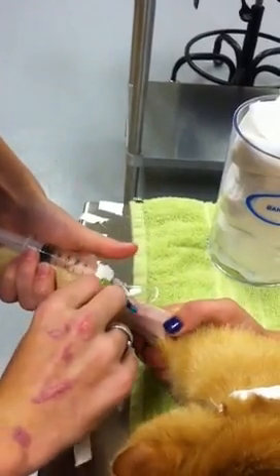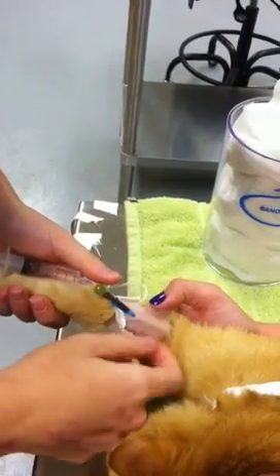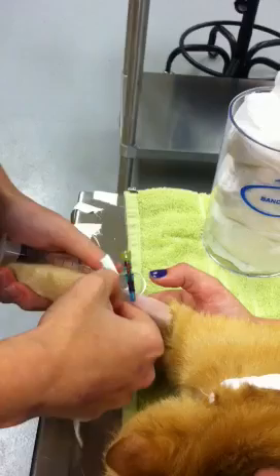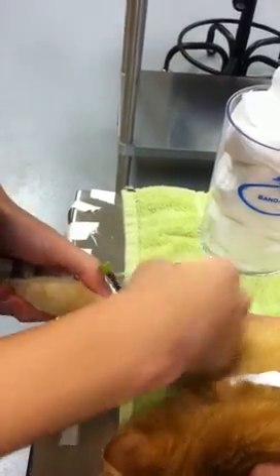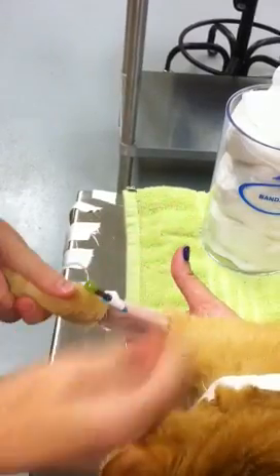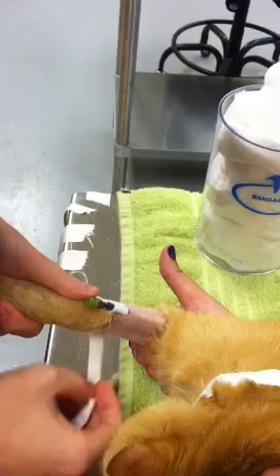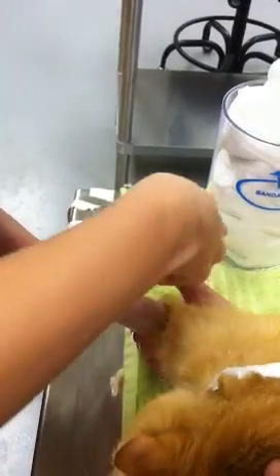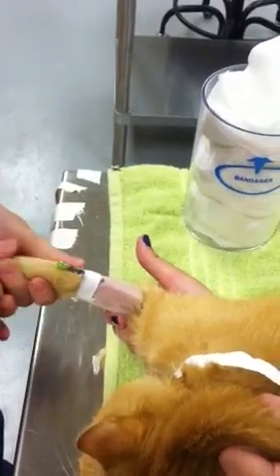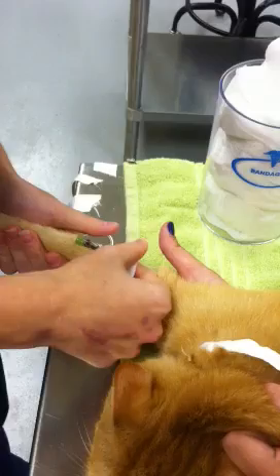I'm going to start taping by placing the sticky side up, placed under the catheter hub. Heather is doing an excellent job holding the cat here and I'm being careful not to go over my actual insertion site. This is our initial anchor piece — it's going to hold the catheter in place. My next step is to go back over the site.